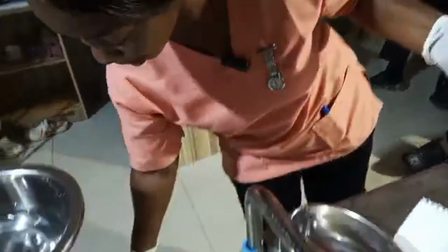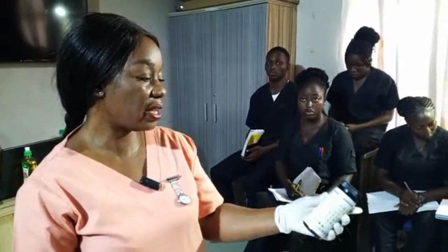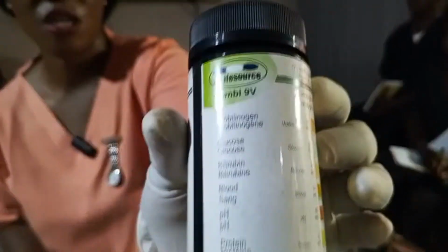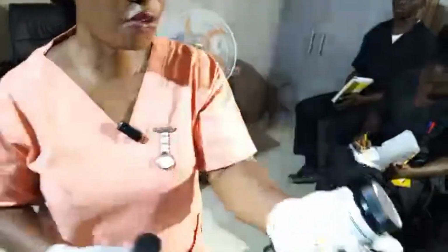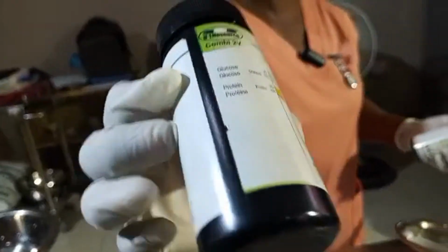and I discard. Do not forget, sometimes you can use this Combi 9. This is Combi 9 and this is Combi 2V. So you can also use this strip to know the pH of the urine, right? Of course, it's been written there. Do you understand? For this one, it's only glucose and protein.